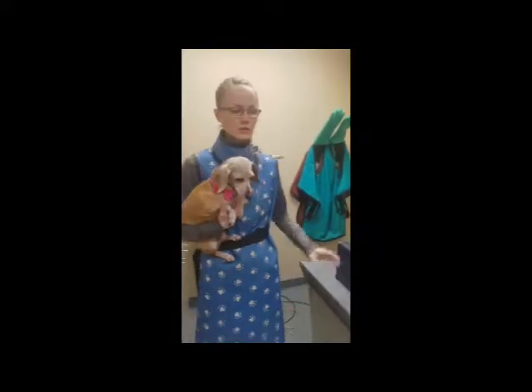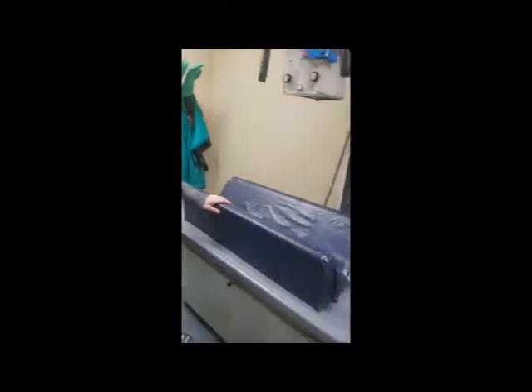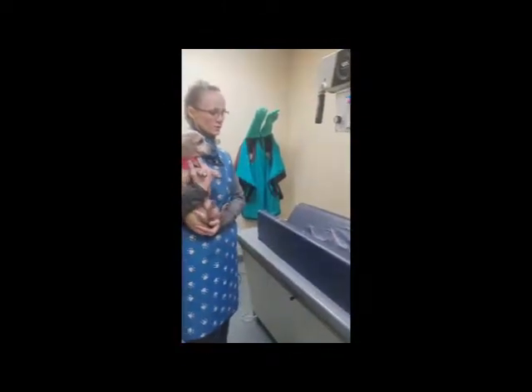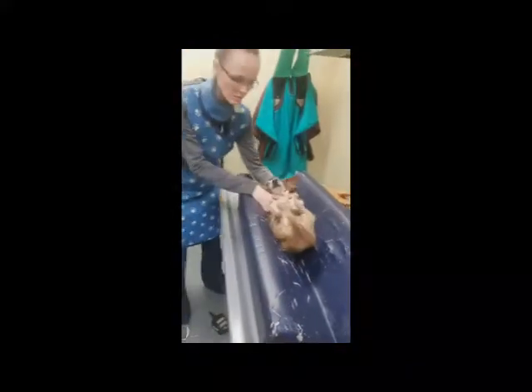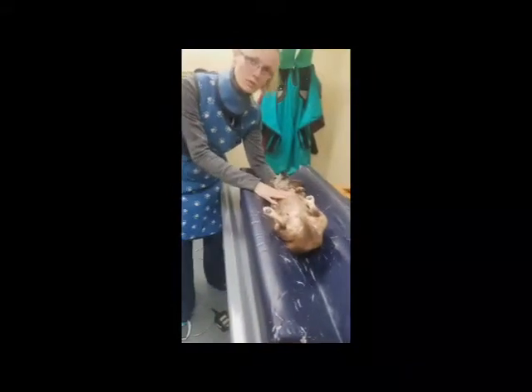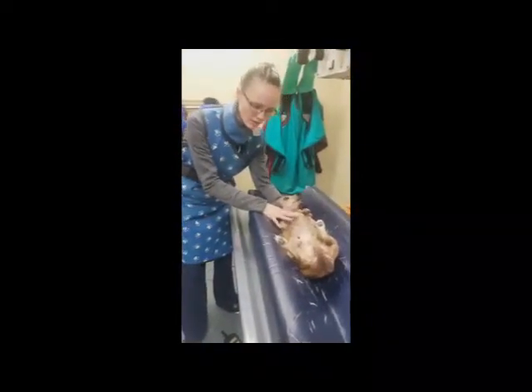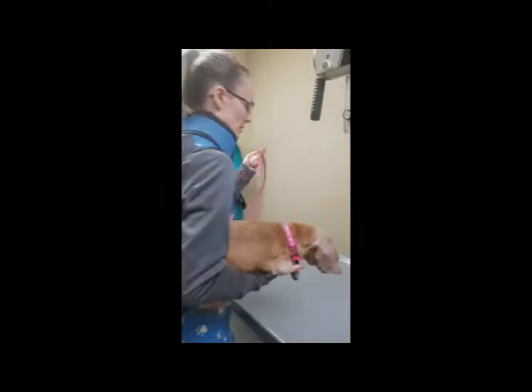I'm going to show you three tools that can help you restrain during x-rays. This is a V-trough. The best time to use this is when you're doing a VD x-ray. You take your animal and lay them down on their back. This supports their body and makes it so your x-ray can be more aligned and straight so that the picture isn't twisted and you're not putting your body into the direct primary beam.